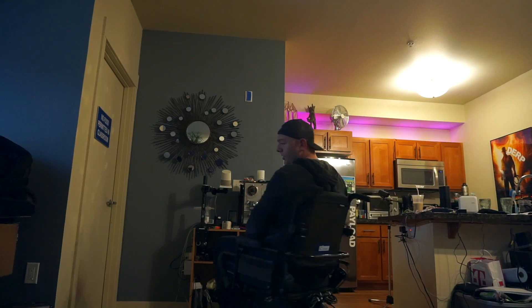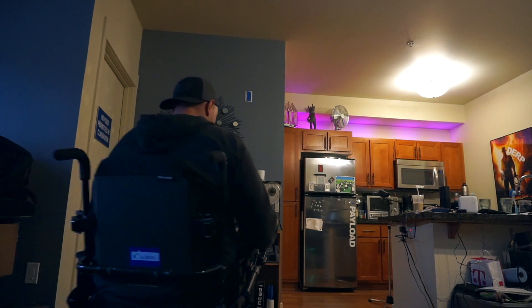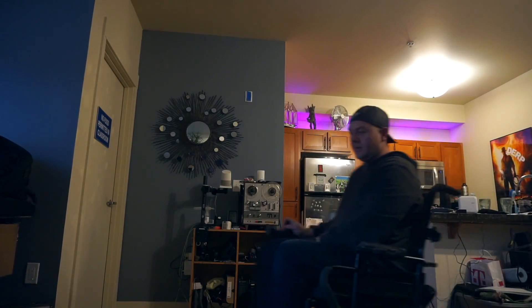Let me hop in this chair real quick and show you what the performance adjustments are actually like. We made very small adjustments, but on this chair small adjustments are huge. Even though I called it a soccer profile, typically for soccer your chair is going to need to be a lot more turned up. Right now the way it's set is probably how I would personally program a chair I'm going to be using inside and outside. The turning speed is a lot faster than it was, acceleration is quite a bit more, you can turn at speed, and it also stops a lot faster. Basically in my opinion this just makes the chair a lot more usable if you're in a hurry and want to maneuver around.